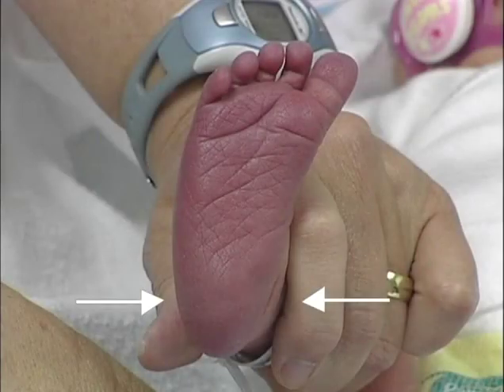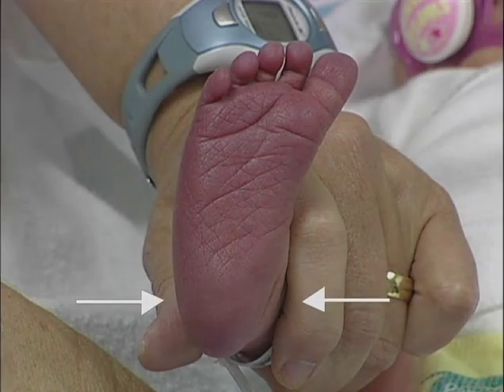When drawing capillary blood gases on newborns and infants up to 12 months of age, the recommended skin puncture sites are the medial and lateral, inner and outer, plantar surfaces of either heel. To prevent bone penetration, punctures to the sides of the heel must not exceed 2 millimeters. Punctures to the arch of the sole or the back of the heel must never be performed.